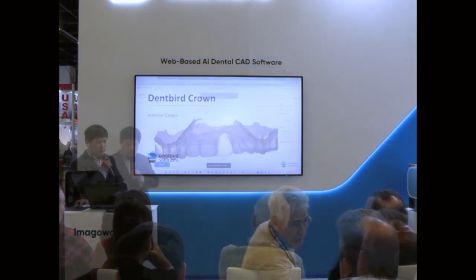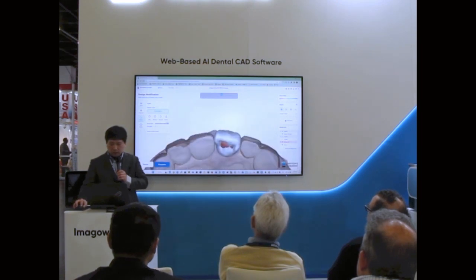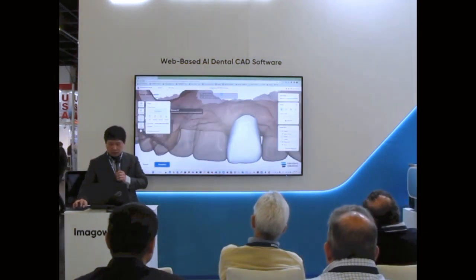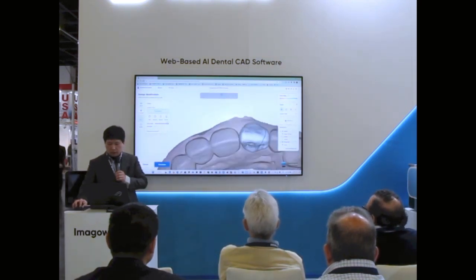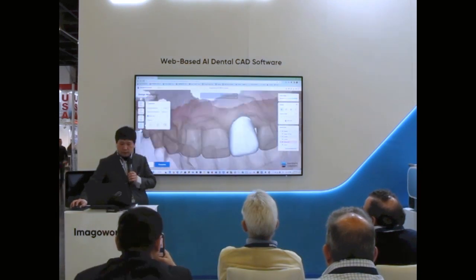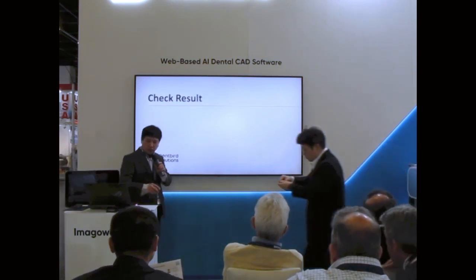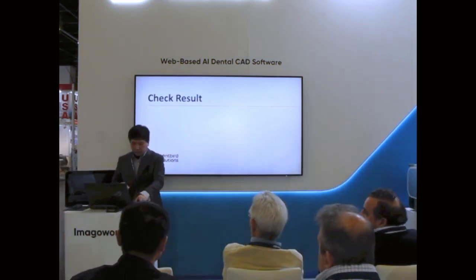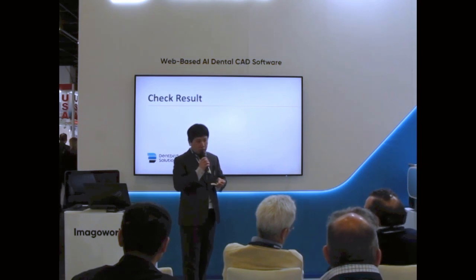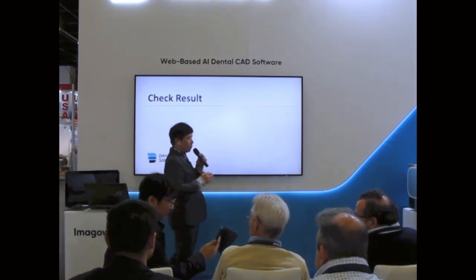Let's design the anterior crowns with a slight modification. The building process has been completed. Let's fit the restoration to the model. I will hide the model so you can see it clearly.